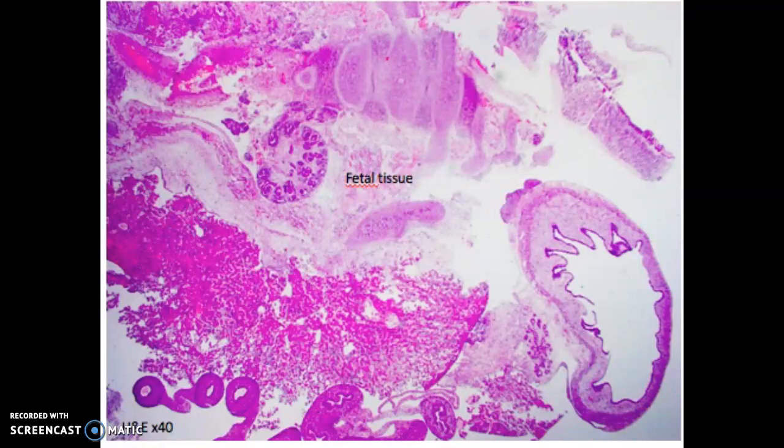And there is presence of fetal tissue here, and these are the ones that are forming cartilage at the side here and probably forming bone as well. And you see these cells are already forming gastrointestinal tract, and there's probably fetal liver here as well.